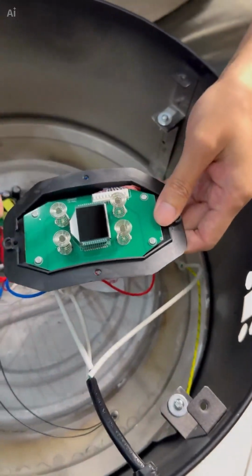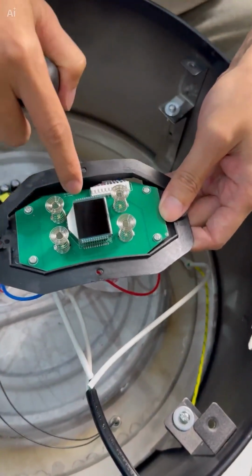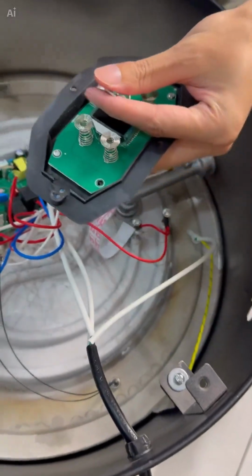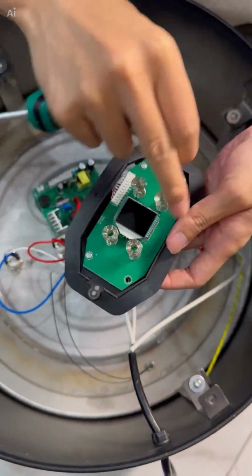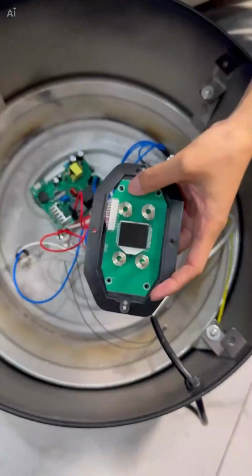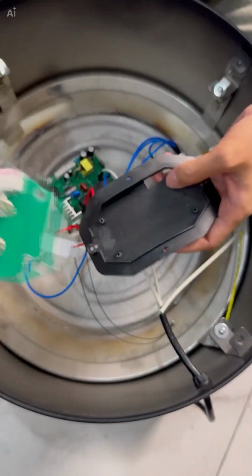Then next, you need to remove these 4 screws to complete the disassembly of the display panel. Be careful, do not lose these screws that secure the display board. These 4 screws need to be kept properly. Alright, now we can remove this display panel. Okay.